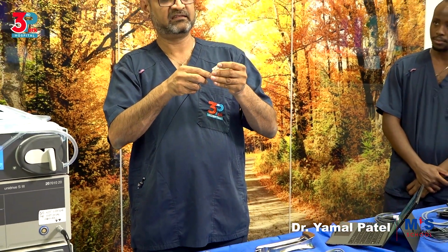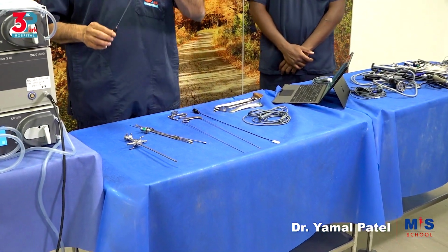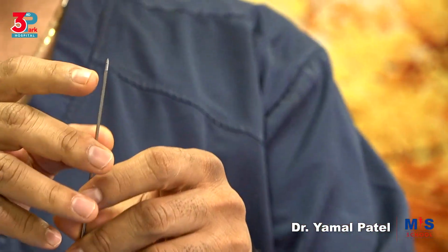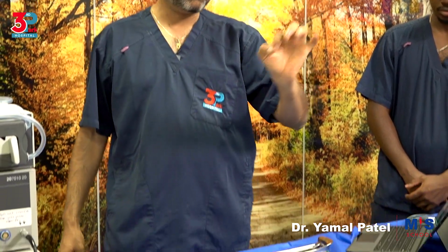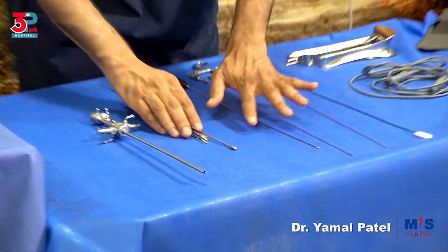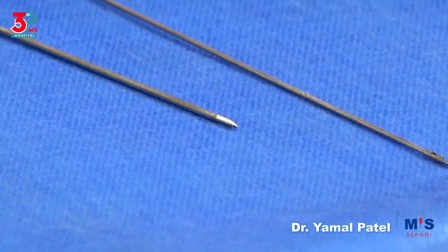So this is to be protected. That is your bipolar needle. Then you have a myoma spiral. Like a myoma spiral that is for open surgeries or for laparoscopic surgeries, we have a hysteroscopic myoma spiral. You can have a tenaculum that is used to hold the fibroids and pathology if it is fine. These are specific instruments, and the instruments that are 5 French are the most common.